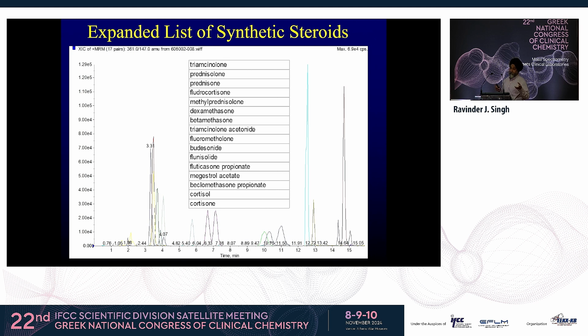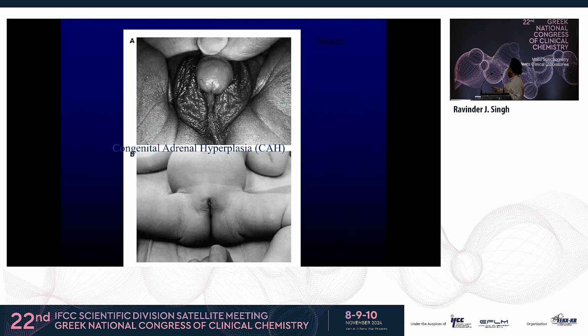We could have easily missed it because these steroids are hydrophobic. They sit in the body, in the fat. But the doctor was very happy to see at least what was causing it. She just waited another 6 months, and this girl's symptoms were resolved. So this was touched on yesterday, that we do have mass spec steroids which can be used.